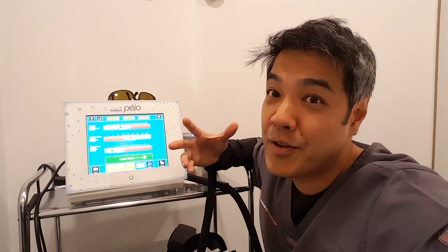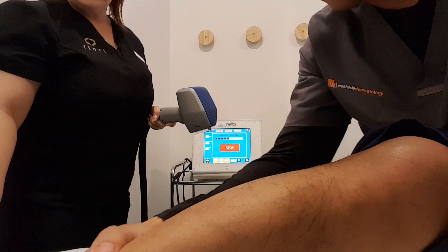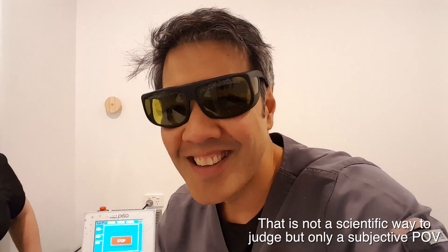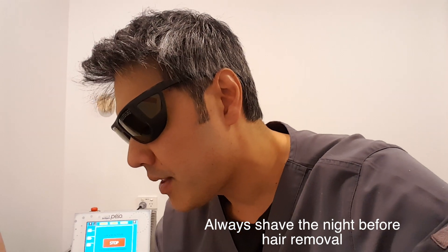We're going to have one of my therapists do it, and I'll tell you how it hurts shortly. So here I am getting some hair removal. Unlike IPL devices, this doesn't need gel. I've already got an area here that I've treated with the Lightsheer by Luminous — I kid you not, I only had one treatment and I'm hairless. So we've got this tiny patch over here. Hair should be shaved beforehand, because otherwise the energy gets absorbed by the hair rather than the hair follicle itself.